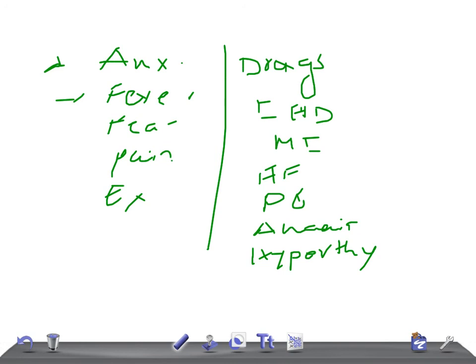One important clinical point: if there is a persistent sinus tachycardia, this should lead to suspicion that the diagnosis may be incorrect. Both atrial flutter and atrial tachycardia can, on casual inspection, be mistaken for sinus tachycardia — so always consider these two possibilities.